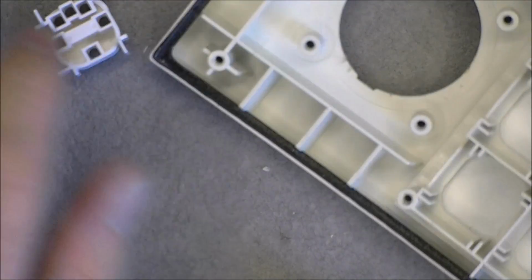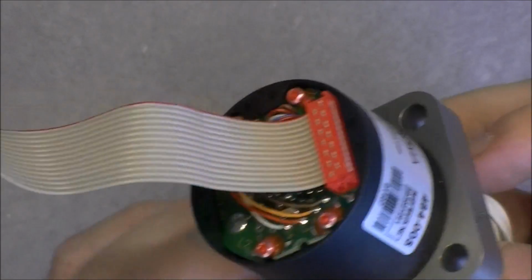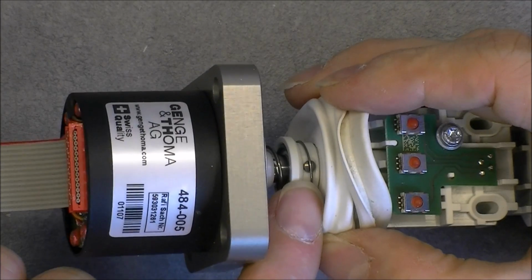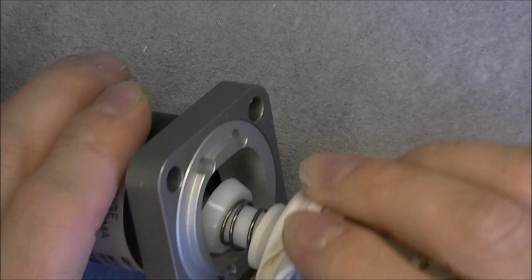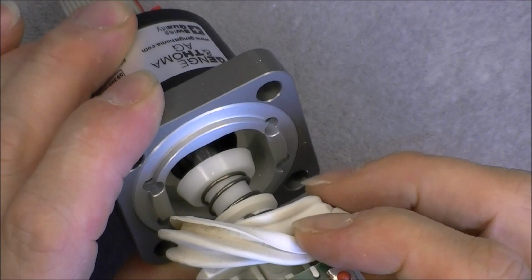And in fact, in the meantime, all the buttons did come off again. Okay, not a big deal. So here we are. We can see what we have under this piece. Seems quite complicated. So I did already try another one. These are not screws. You cannot turn them. So it must be some kind of pin. You have a nice spring, nice metal piece here.